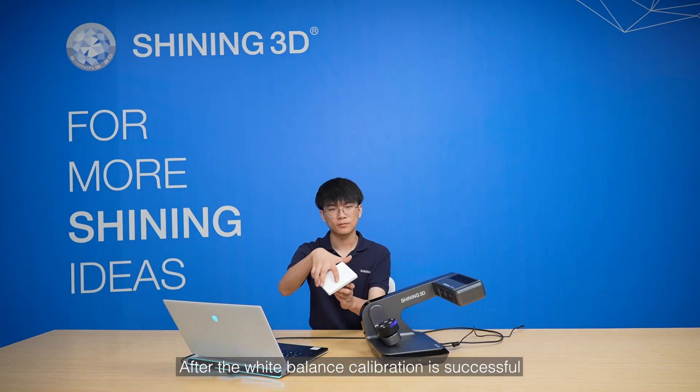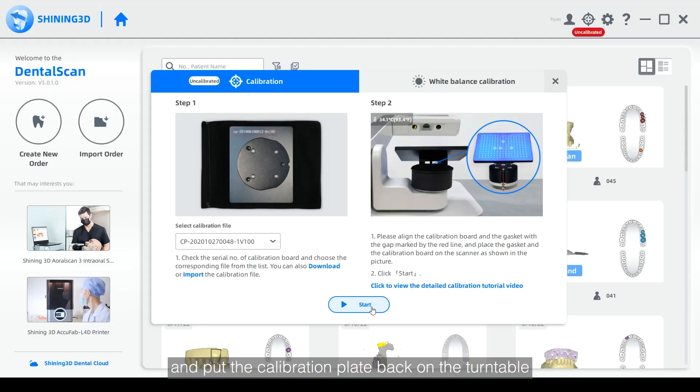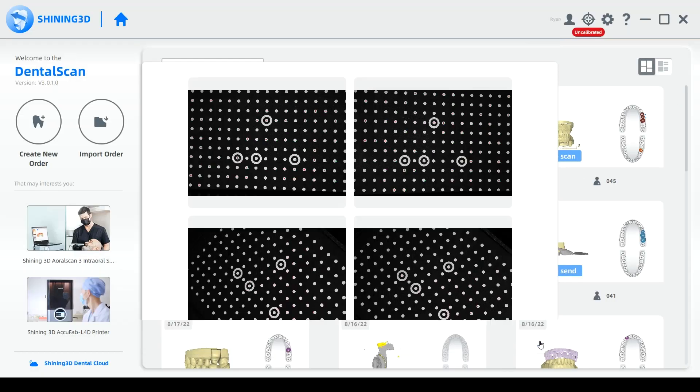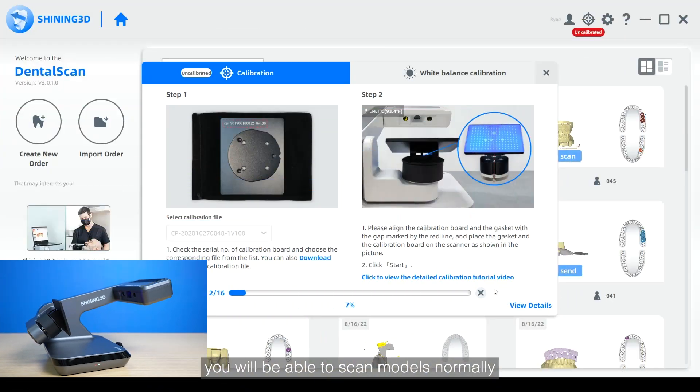After the white balance calibration is successful, remove the white plate from the calibration plate and put the calibration plate back on the turntable. You can view the calibration details and the calibration rate of progress here. After all the calibration processes are over, you will be able to scan models normally.